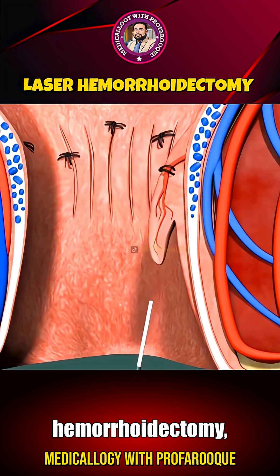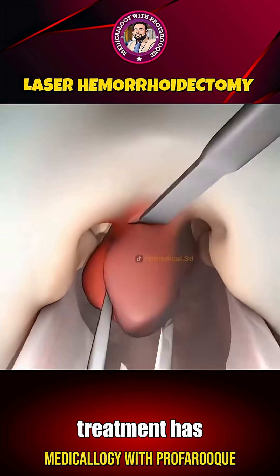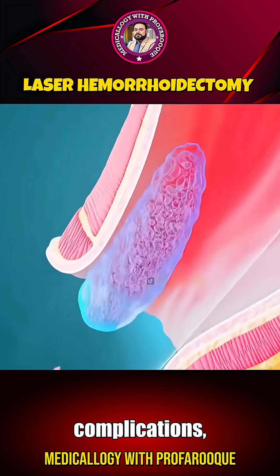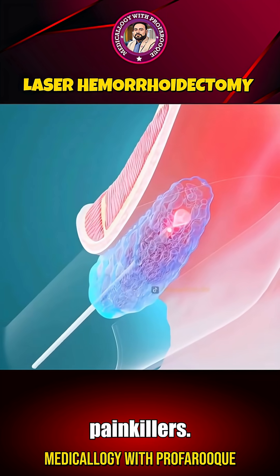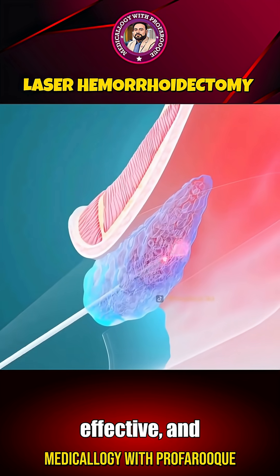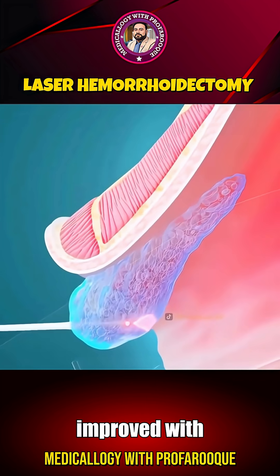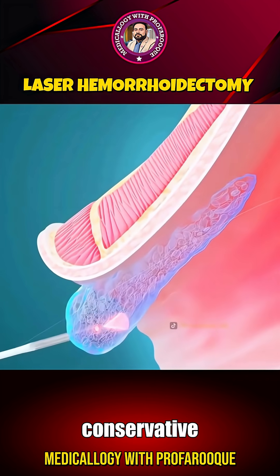Compared to traditional hemorrhoidectomy, laser treatment has a much lower risk of infection, quicker wound healing, fewer complications, and a reduced need for painkillers. It's a safe, effective, and advanced treatment option, especially for patients who haven't improved with medication or other conservative therapies.